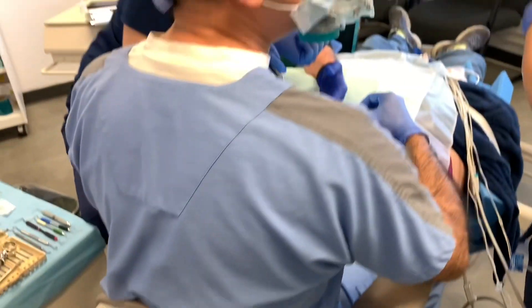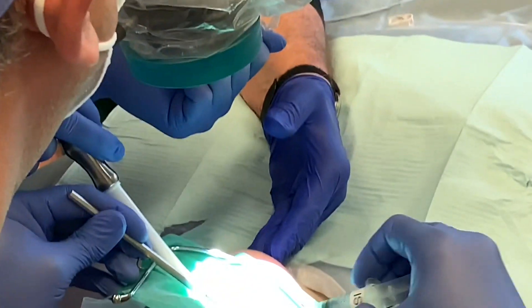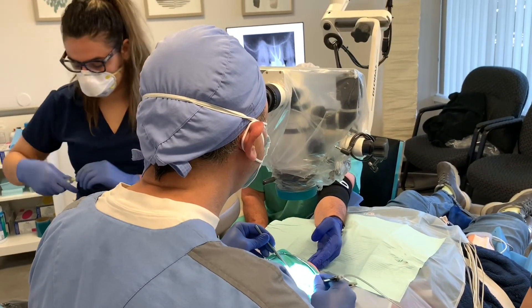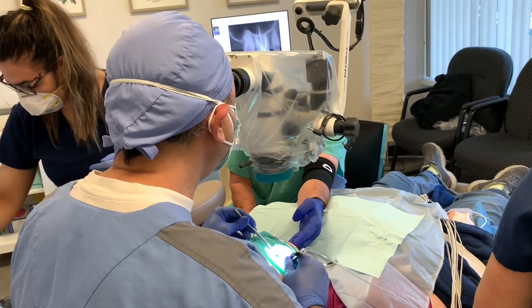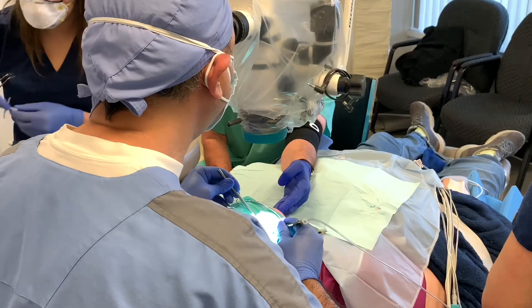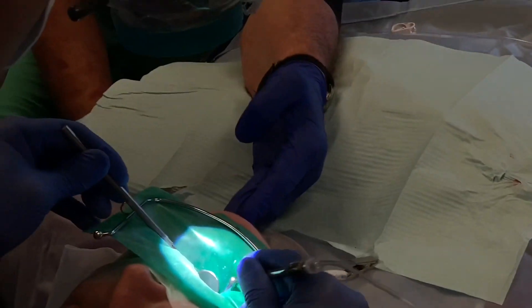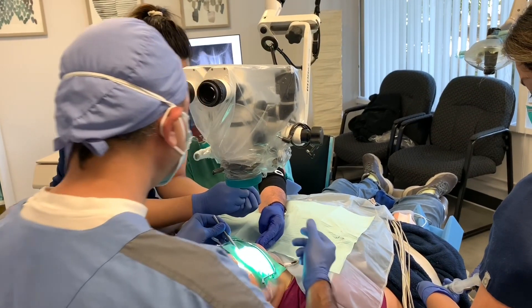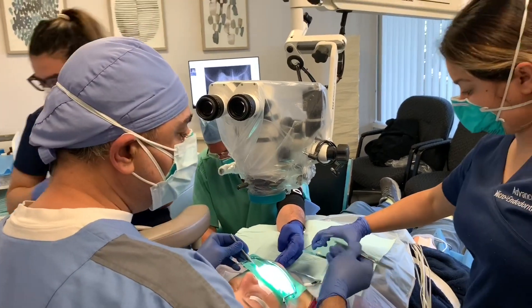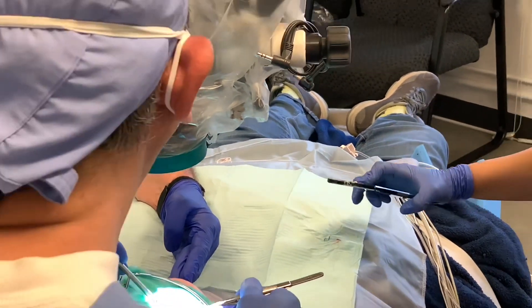I don't use EDTA — I don't use 17% EDTA. With the micro-suction, you save on paper points because the micro-suction removes 99% of the moisture and air from inside the canals. I then use a paper point to deliver my sealer into the canals and coat the walls.